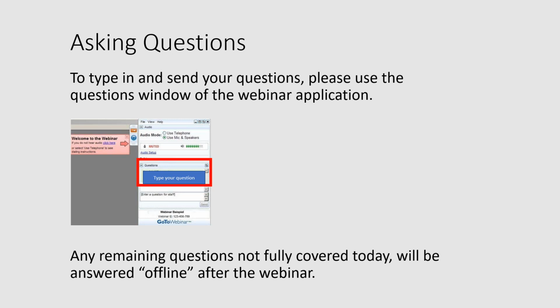I think that is a really good question, and the biggest difference is that the image on the Navilas screen is a two-dimensional image compared to a stereoscopic view on the slit lamp. However, we know that not all slit lamp delivered lasers always allow for as good a stereoscopic view as the examination slit lamp in the clinic room, for example.